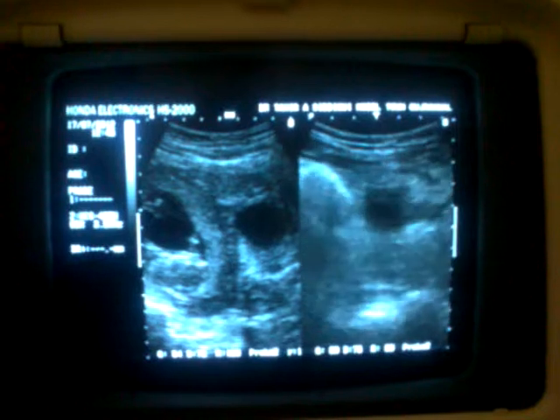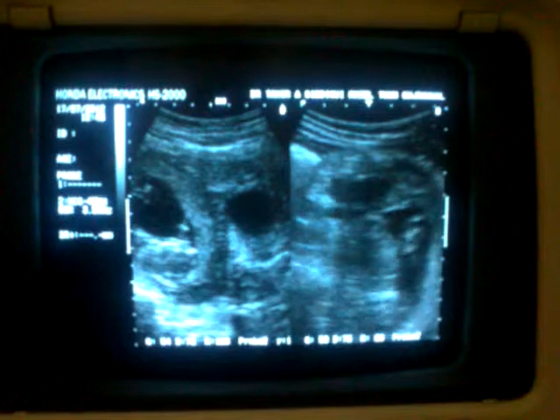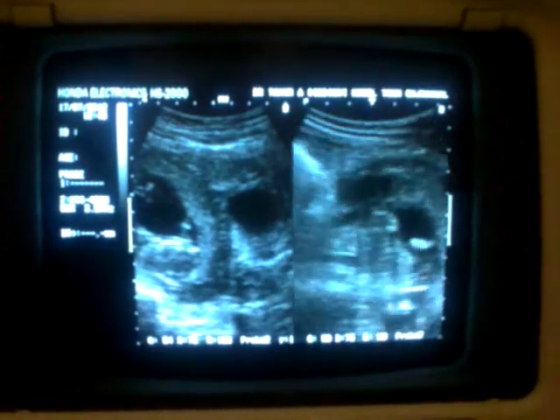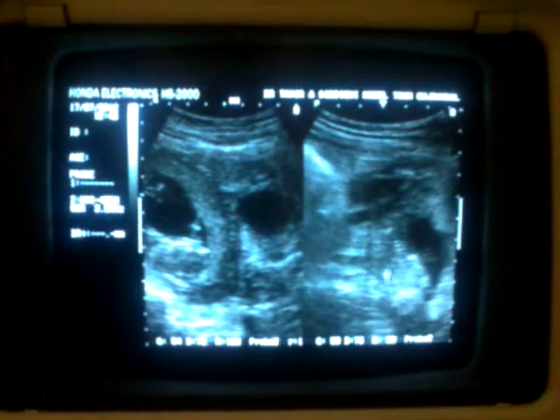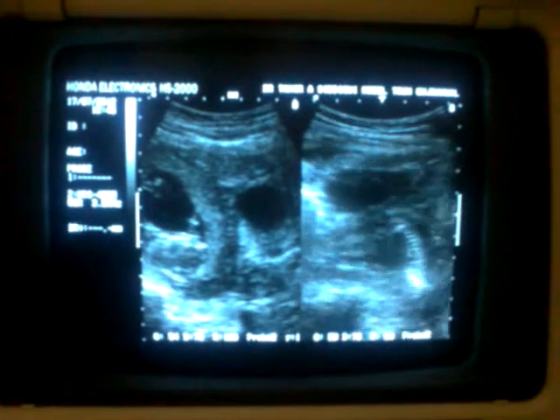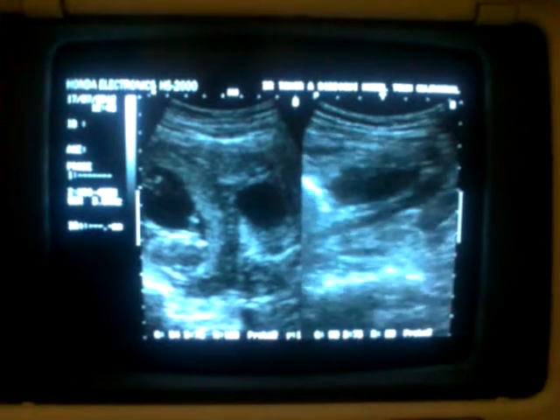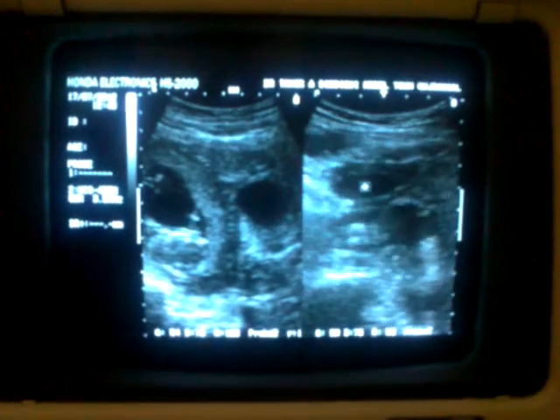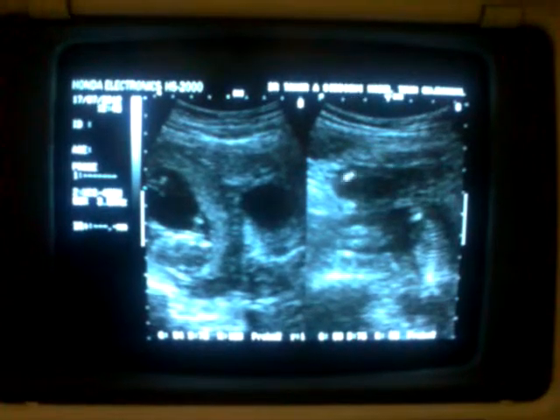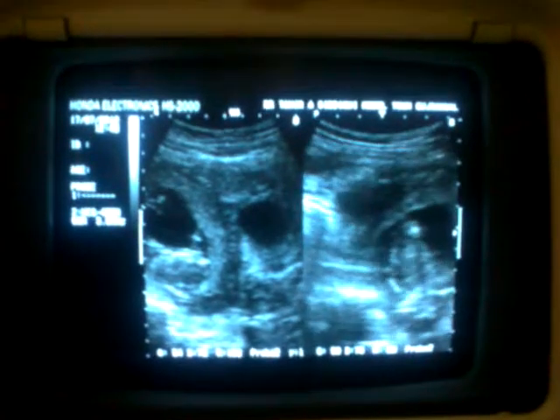So this is the third sac with decidual reaction, but not intact. I am now going to keep your concentration on this area. I am going to give a sweep to see if it changes its shape or not. It does not change its shape. This is the third sac, and it has a broken echogenic ring around it with blood seen posterior to it.